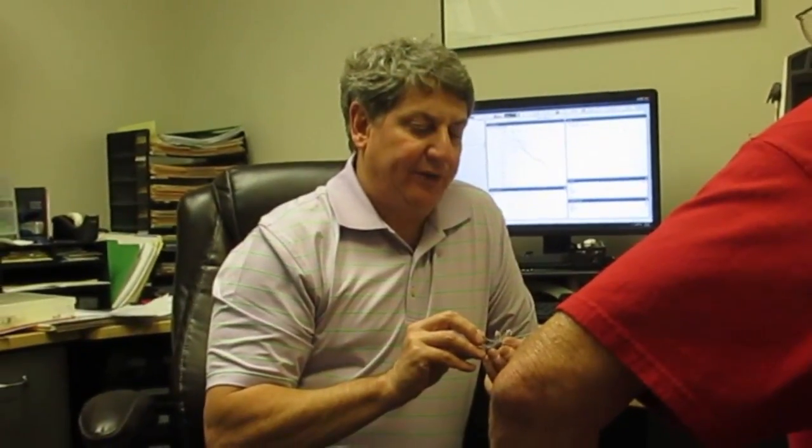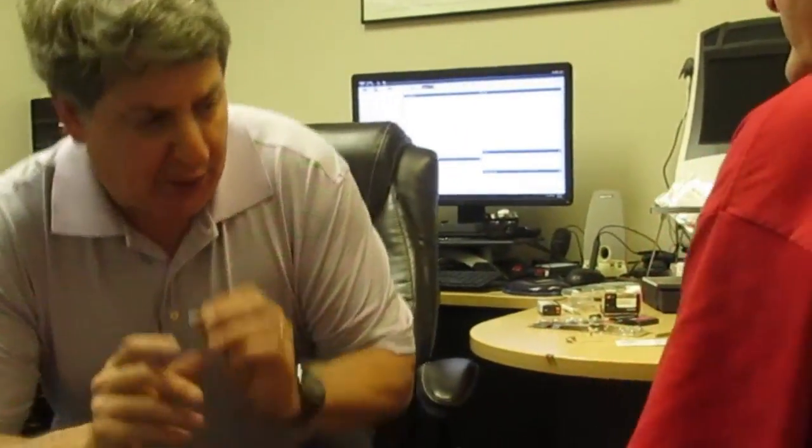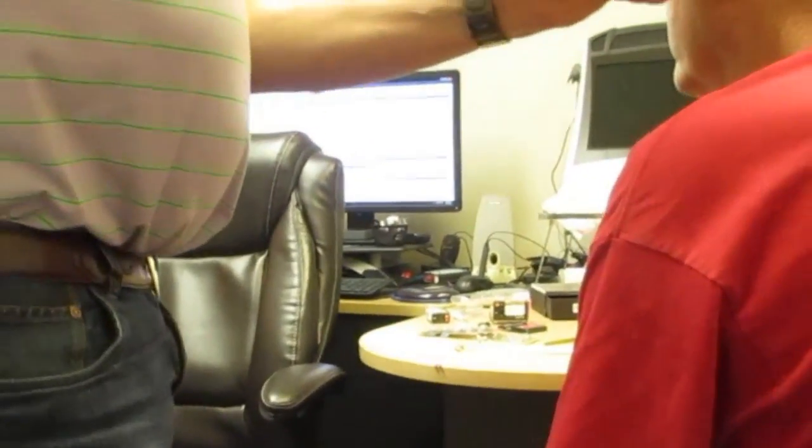So now it's on there — there's one on the left and one on the right? Notice how one of them is red and one of them is blue on the tip. Red is right — R-R. So this is going to go on your right ear and then this one will go on your left ear. I will put it on right now and then I'll show you how to do it afterwards.